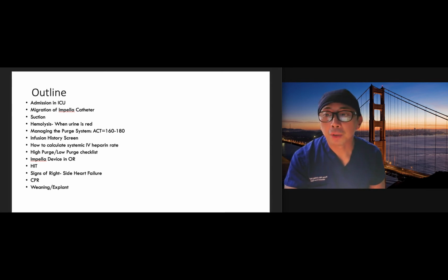What happens with a high purge pressure? There are some checklists and to-do lists in there that you need to take some notes on, about what to do next. What about a low purge pressure? They have the checklist provided in there and they tell you what to do next.